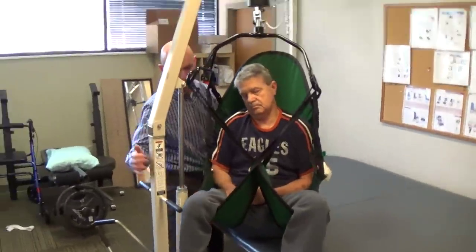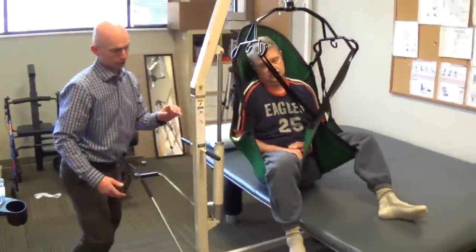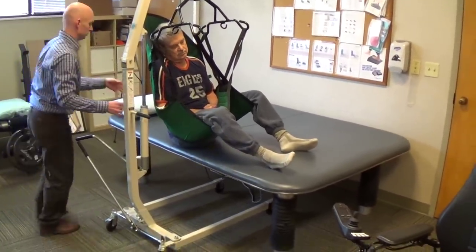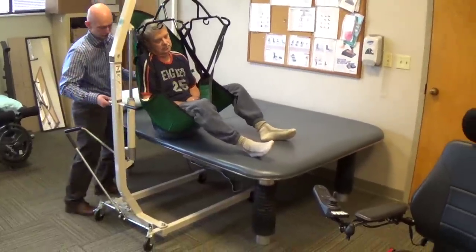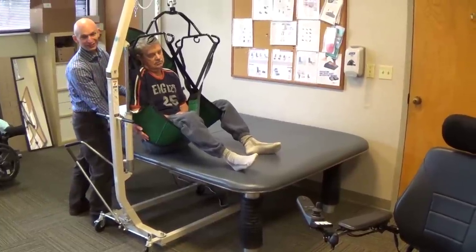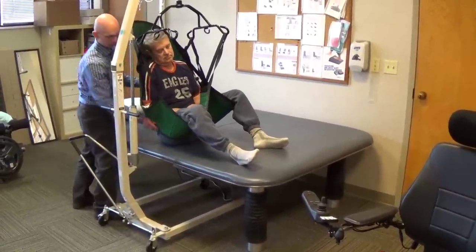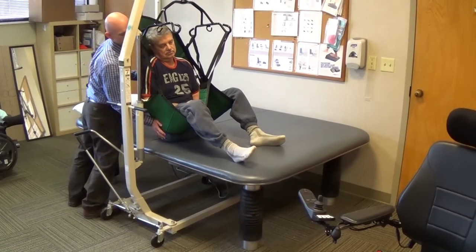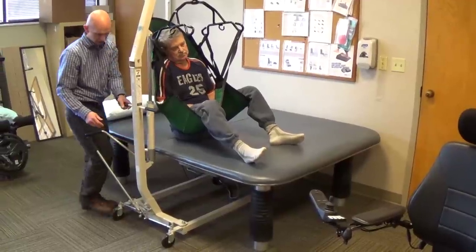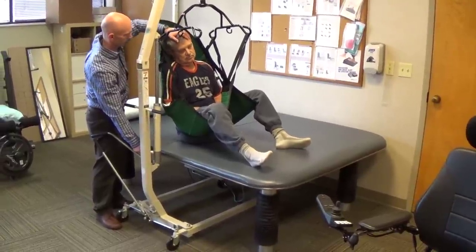Depending on the heights of some beds, you still might be required to do a little bit of lifting. Pushing the lift all the way in, and then it's easier to move the person when their weight is supported by the lift, and moving them towards the middle of the bed, where they will be lying. Next, locking the brakes again, and then slowly lowering the lift back down.